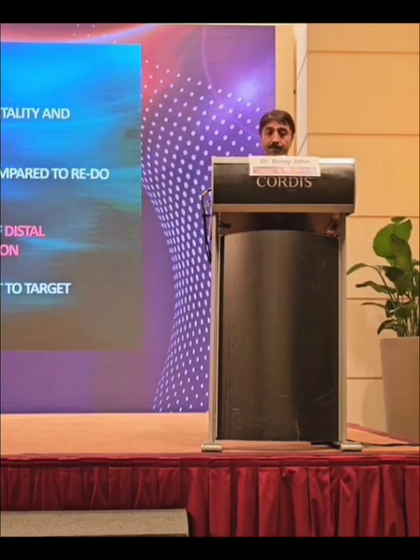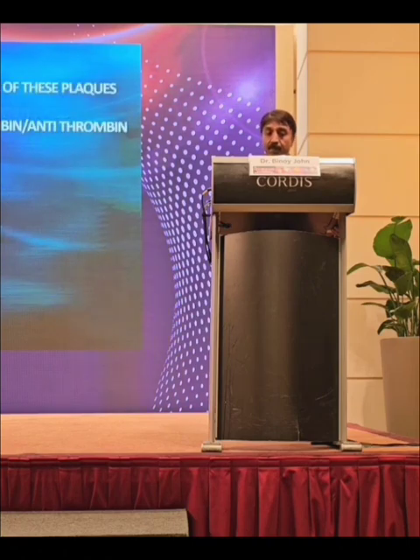So, what do we do? PCI or redo CABG? Which is better? Redo CABG is associated with high risk, morbidity, mortality, and risk of damage to a patent LIMA. This makes percutaneous intervention a good option compared to redo CABG. However, SVG angioplasty is associated with a high risk of distal embolization and slow flow, no reflow phenomena. Therefore, in highly degenerated grafts and CTO, it is best to target revascularization of the native coronary artery.